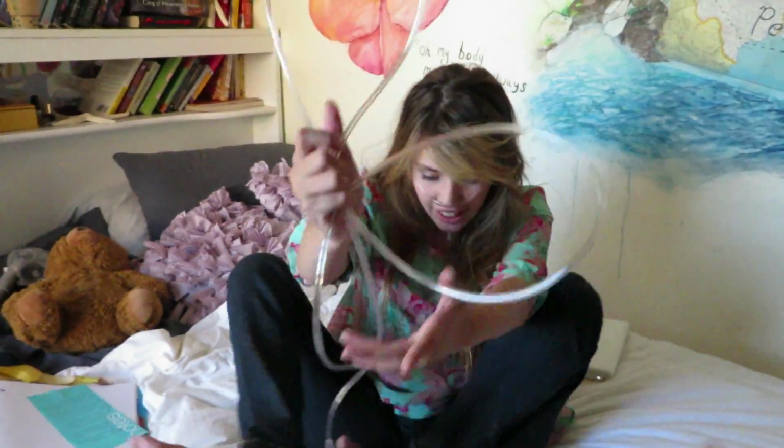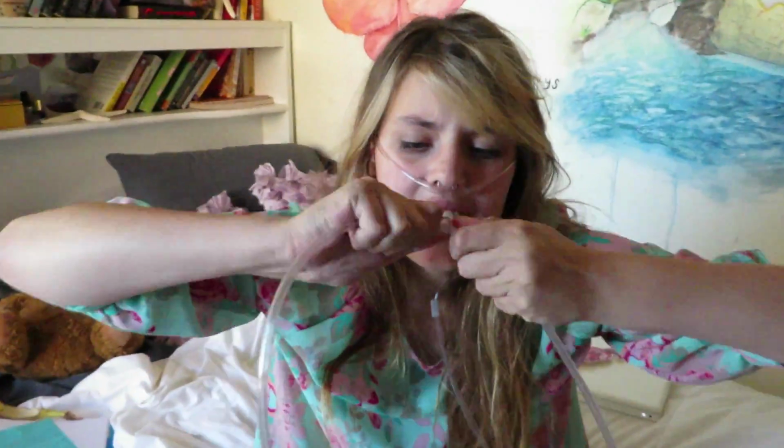First and foremost, about oxygen tubes, you'll see here, I have this little adapter thingy. This can come off. So this attaches to an actual oxygen tank or concentrator that I wheel around with me in my day-to-day life. And then I come home and I plug it into this, and all of a sudden it's attached to a 75-foot tube that goes through my entire house.